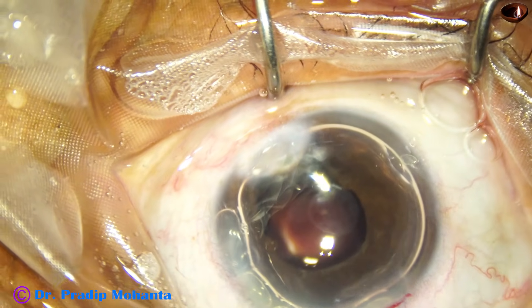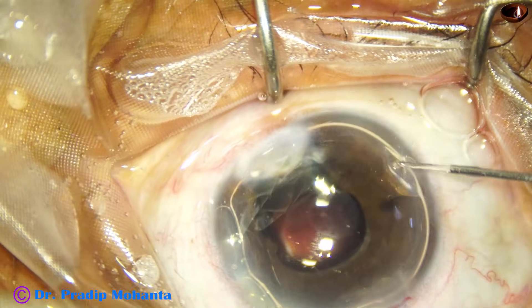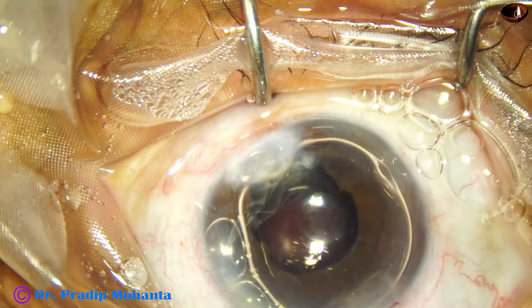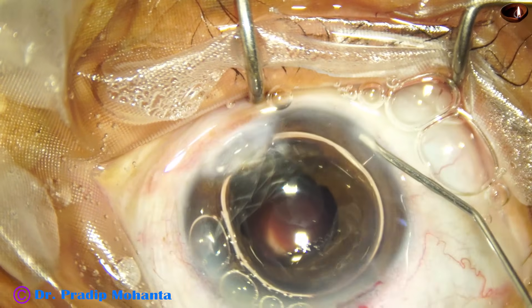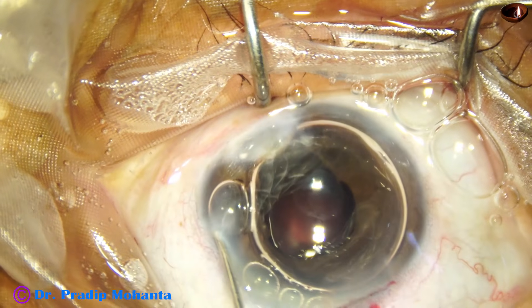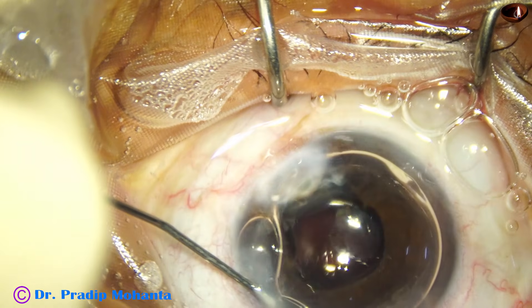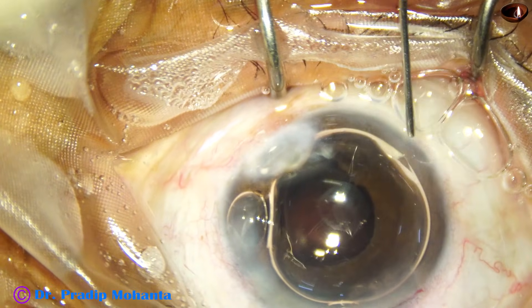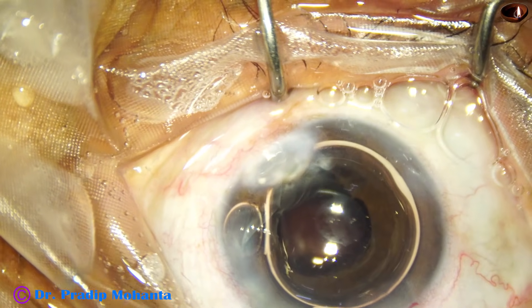An air bubble is injected to maintain the anterior chamber. After using bimanual irrigation aspiration, if you find that the anterior chamber is becoming very shallow, inject an air bubble and then do side port hydration. After side port hydration, you can use the irrigation cannula through the main wound and this air bubble will come out.